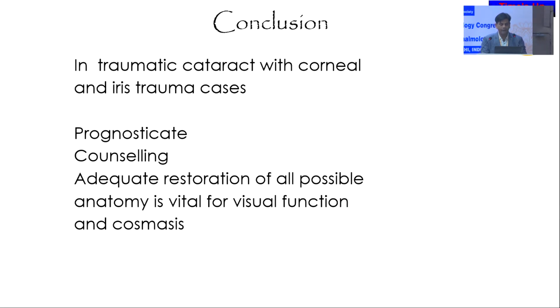So to conclude, in traumatic cataract with corneal and iris trauma cases, we should prognosticate first and counsel the patient well, and adequate restoration of all possible anatomy is vital for vision and cosmesis.